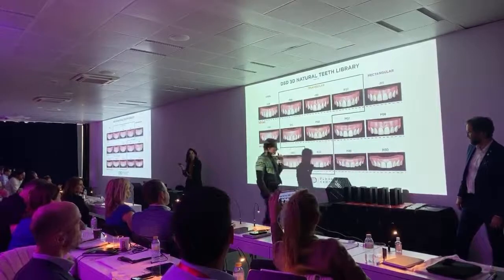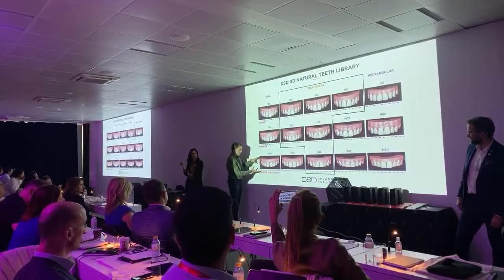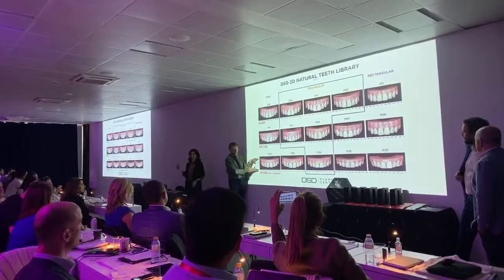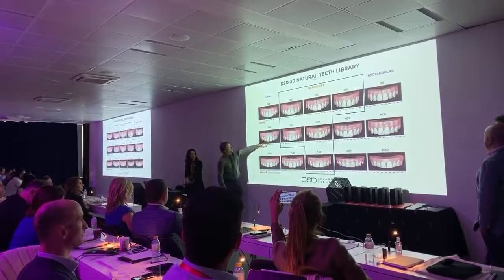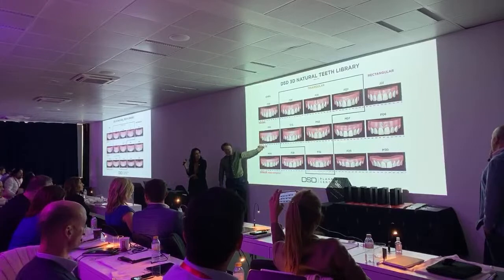So we want to take teeth, maybe 40, 50, 60 years old, still beautiful, because we have few people out there with amazing teeth. And this is the teeth that we want here, and then we're going to divide into oval, triangular, rectangular. Then you're going to have mid-age, and you're going to have the young ones, okay? So you will all receive this.